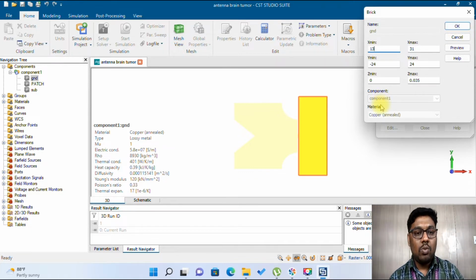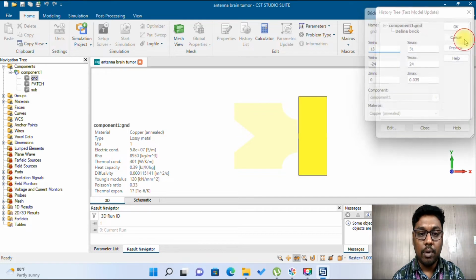This is one method to achieve bandwidth by reducing your ground length. By properly adjusting the ground length, you can get a wideband, or you can shift your resonant frequencies, or you can shift the depth of your return loss as well. That is one kind of mechanism.